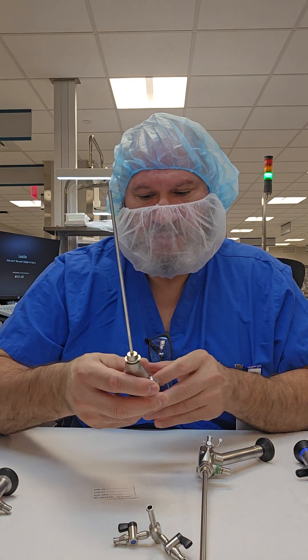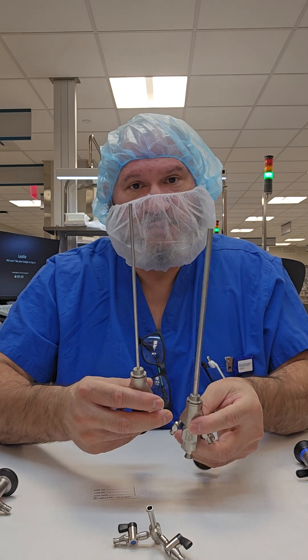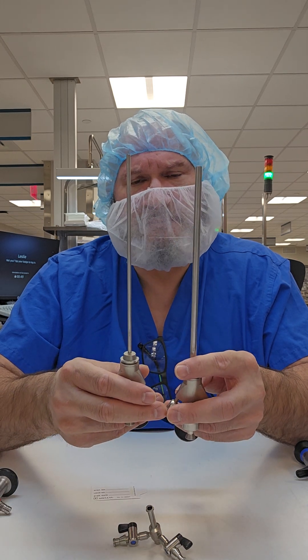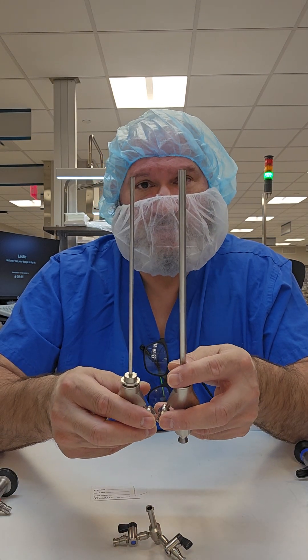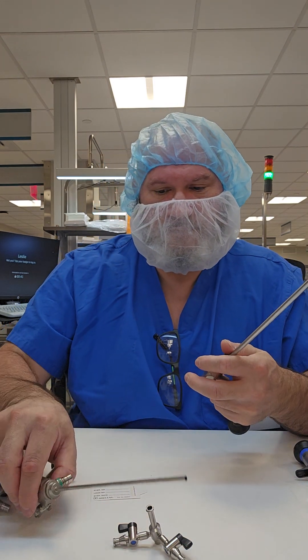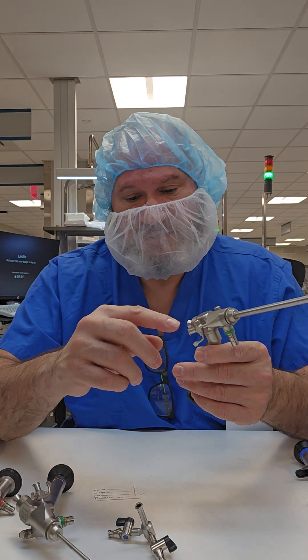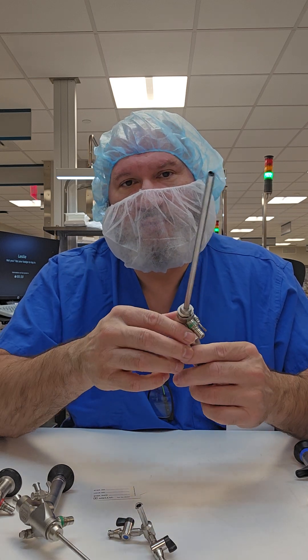Scopes come in different diameters — this one is a 5mm scope compared to this one, which is a little bigger, maybe around 8mm. 10mm is quite a bit larger than that. You can see they come in different diameters, and this scope too can have accessories attached to the end, so make sure you remove those accessories.